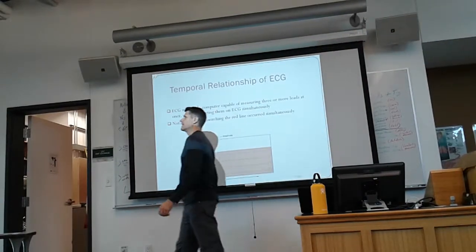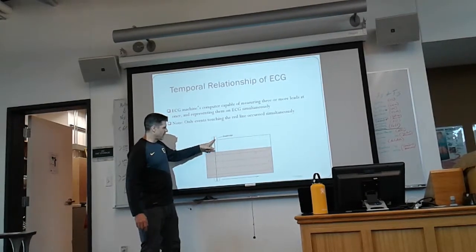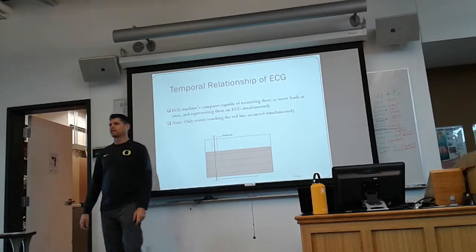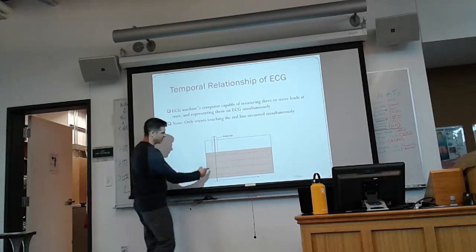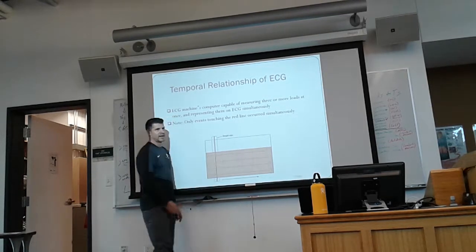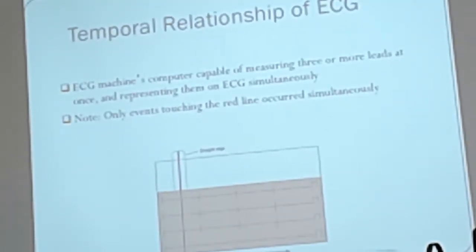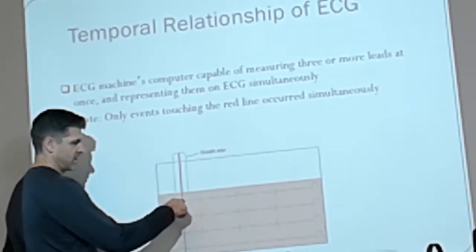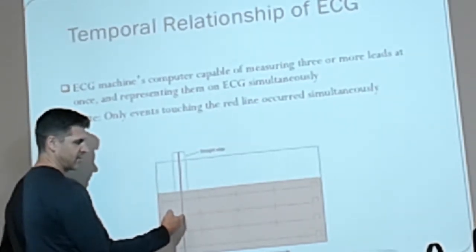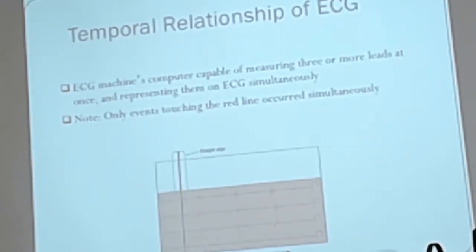What that means is that on an EKG, everything from north to south is happening simultaneously. That event, because time is our x-axis, everything that happens on this vertical line happened at the exact same moment. Does that make sense? So if there is a P wave here, and a QRS complex here, what does that mean? The QRS is coming on top of the P wave. The ventricles are contracting on top of the atria.